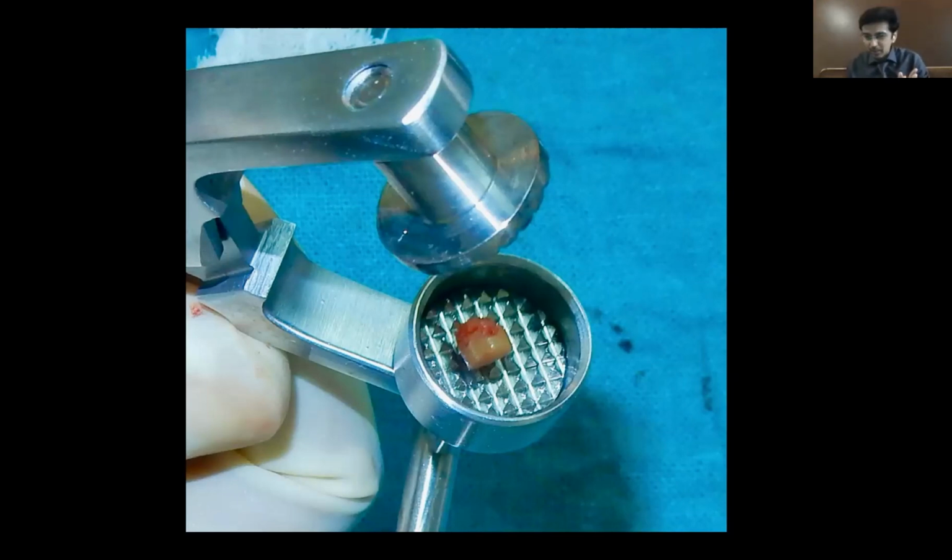How many days after placing an implant should it be? How many days after placing bone grafts? No, you are talking with regard to socket preservation. Here we are talking about bone grafting which is done simultaneous to implant placement. I am not covering socket preservation because I don't have time for that. Socket preservation basically meant you extracted a tooth and placed a bone graft, and now you have to wait a minimum of 6 months before placement of an implant. Here we are placing an implant and simultaneously doing the bone grafting.